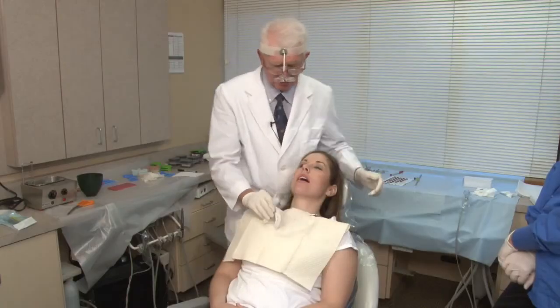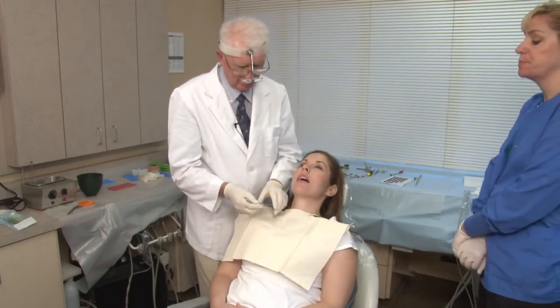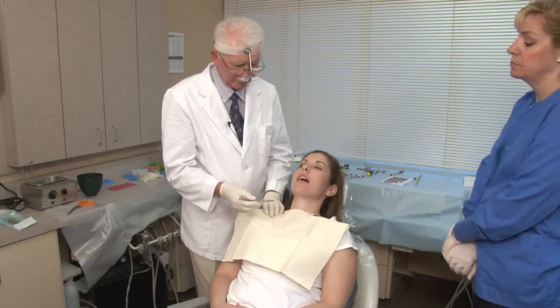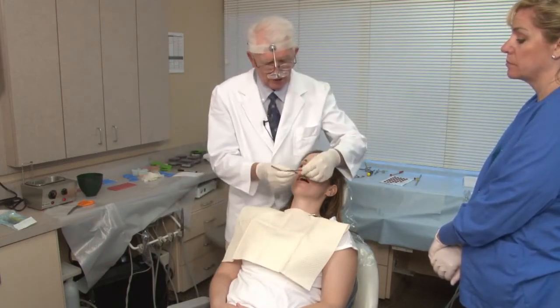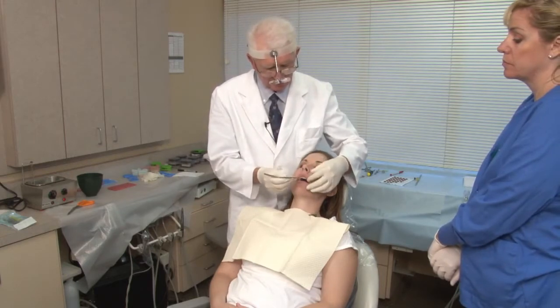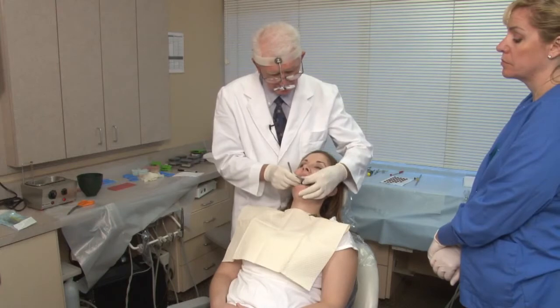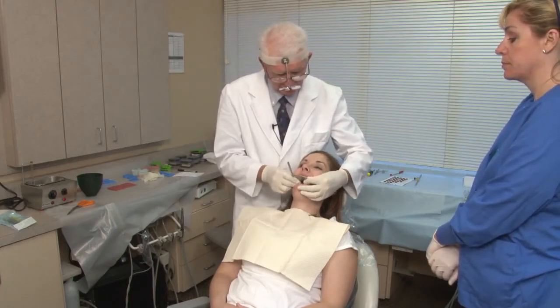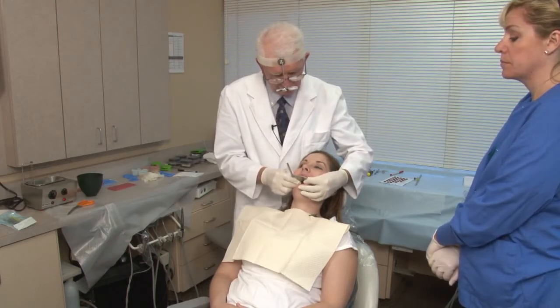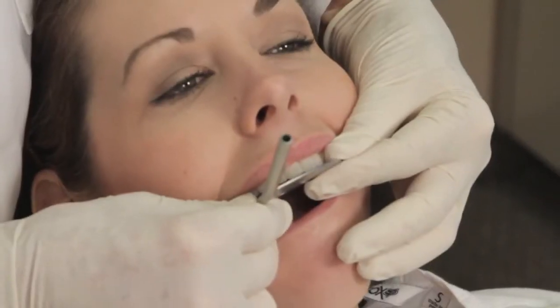Now, the next thing I want to show you, though, because when I do the procedure, you may not get the full appreciation for it. And in taking and registering the teeth into the AccuBites, the upper teeth, I will place it the same. And before I touch the teeth, I'm going to get the midline lined up, and I've got my thumbs on the buccal face of the canine area, and then I can lift like this.